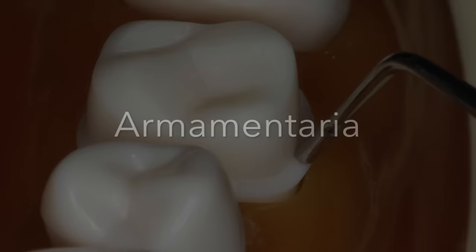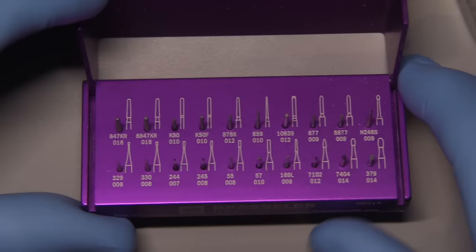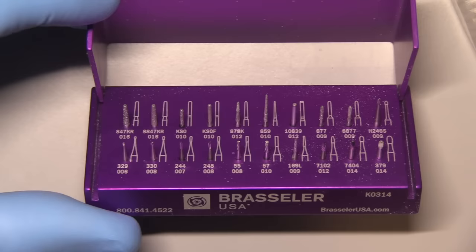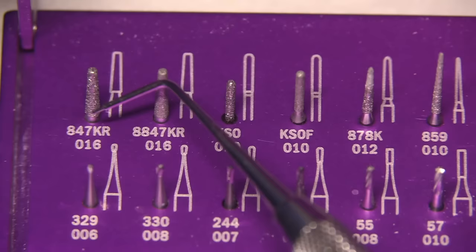Let's take a look at the armamentaria required for this particular preparation. First of all, the burr block. I love this SDS burr block because it's got every burr you'd want to use for all preparations, whether they be all ceramic, PFM, metal crowns, gold onlays, or ceramic onlays. The back row is primarily dedicated to indirect restorations, where the front row is for direct.